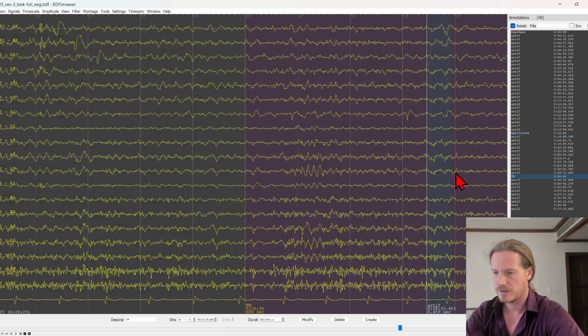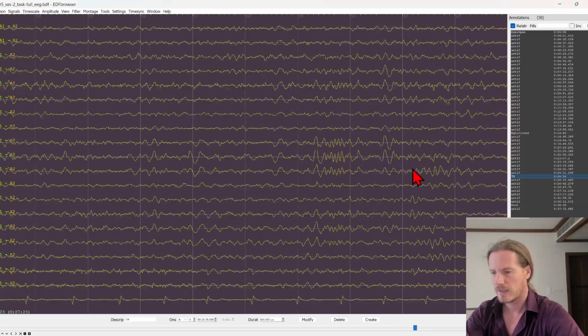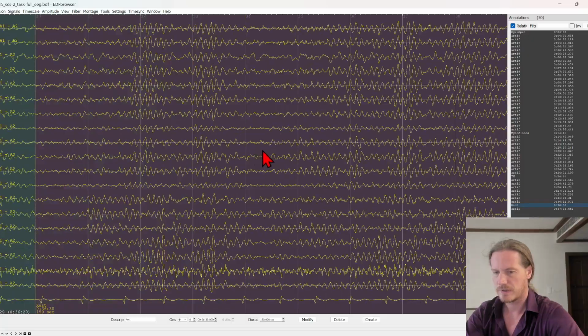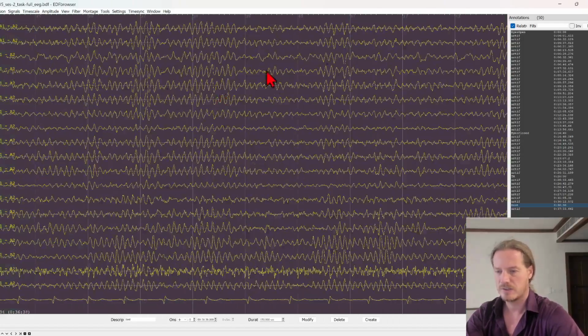And then there's their TM period. Right now they don't have alpha, but I'm sure it will come back. And then we have their rest period. This is the end of their TM. So here's again beautiful alpha waves that continue in their 2 minutes rest.